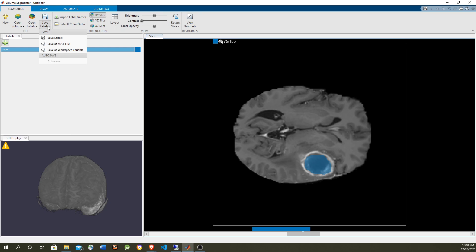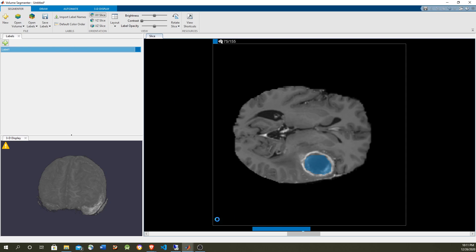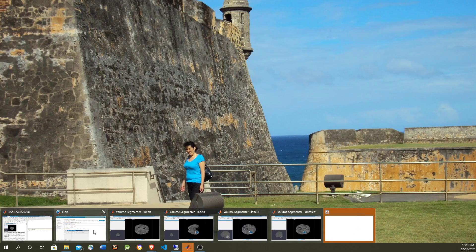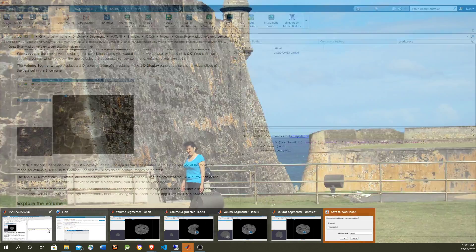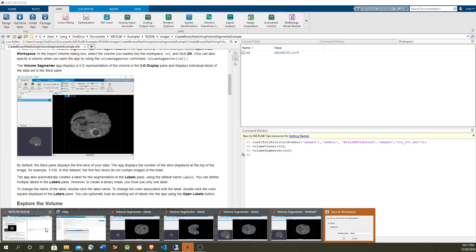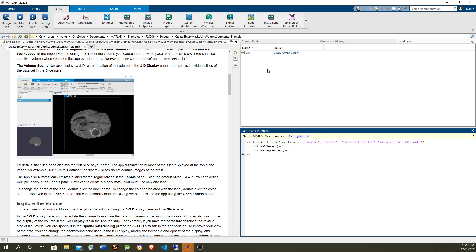So once you finish labeling you can save the labels in a mat file. Once you save it in a mat file then it can be picked up by a data store, and then the data store is going to read it within the train command of the neural network in order to train the neural network. But for this example we're going to save it into workspace where the mat.global variables are. So now we have the volume.